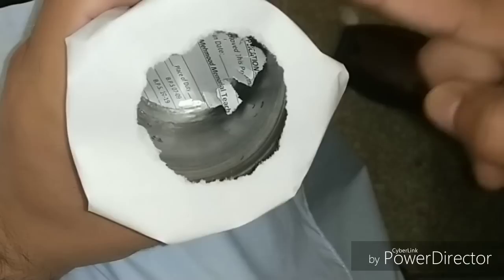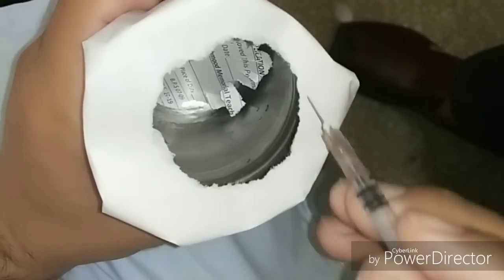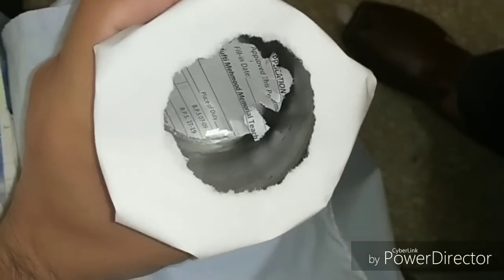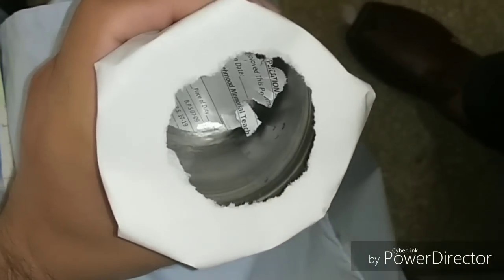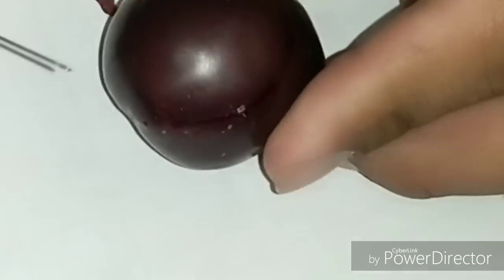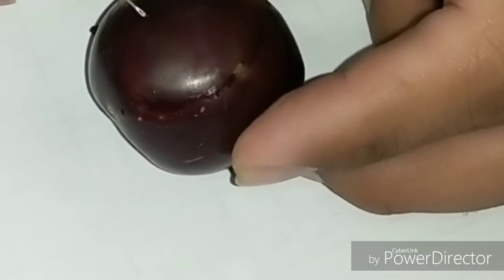Slowly and gradually complete the continuous curvilinear capsulorhexis. This technique is used in phacoemulsification and produces round, smooth margins with no tears.